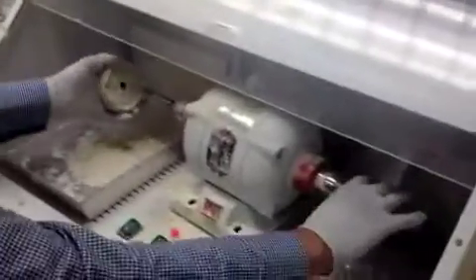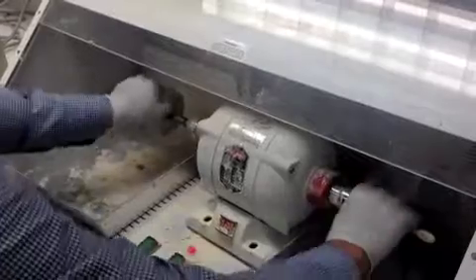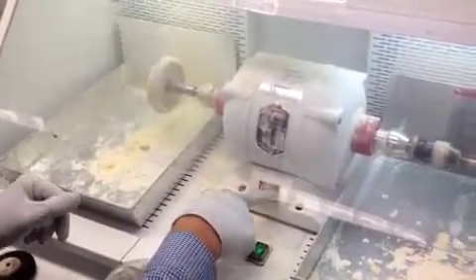Mount your buff wheel for the last step. Make sure it's in place. Put the shield down. Turn on the vacuum and the lights. This is on low always.